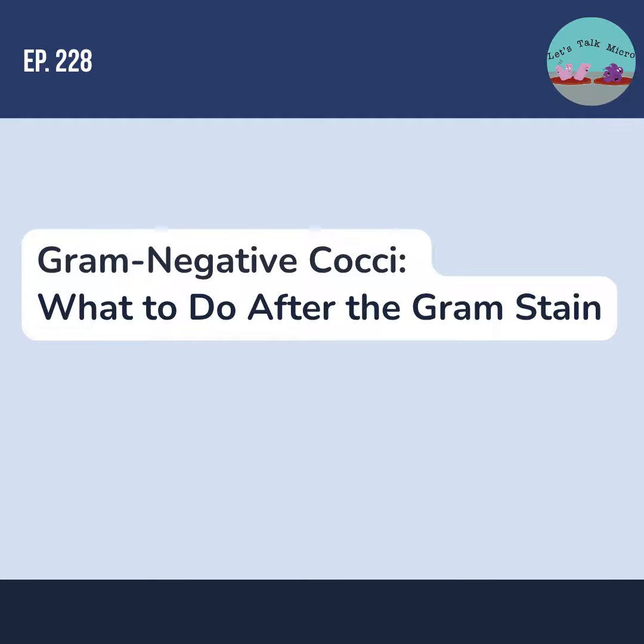Okay, so when it comes to other testing, let's talk a little bit about Moraxella catarrhalis. There's a test called the butyrate disc test, also known as the catarrhalis disc. This test detects the enzyme butyrate esterase, and it aids in the identification of Moraxella catarrhalis. So let's get a little bit technical. Moraxella catarrhalis has an enzyme called butyrate esterase, which releases indoxyl from indoxyl butyrate. This produces an indigo color in the presence of oxygen.